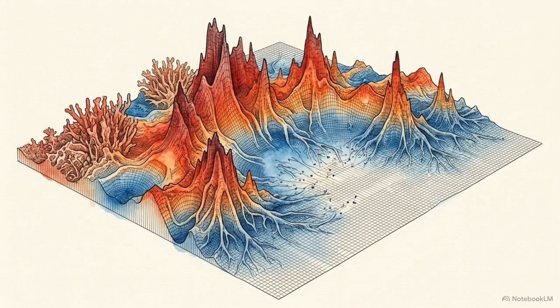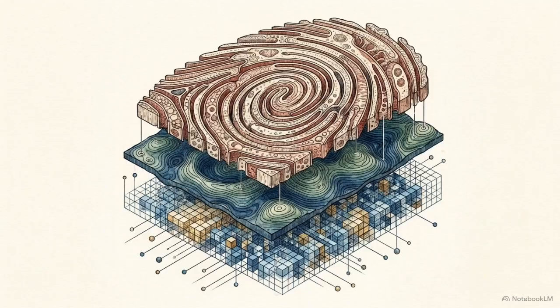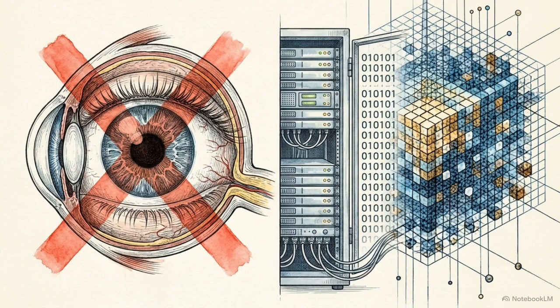Through this process, the AI constructs abstract texture maps. It maps areas of spatial heterogeneity, regions where the numerical jumps between adjacent pixels are mathematically erratic. It isolates exact mathematical anomalies, mapping abnormal pixel clustering and steep density gradients that break the statistical rhythm of healthy tissue. These extracted maps combine to form a highly intricate mathematical fingerprint of the organ. It is a strict quantification of the tissue's physical state, completely disconnected from human visual interpretation.